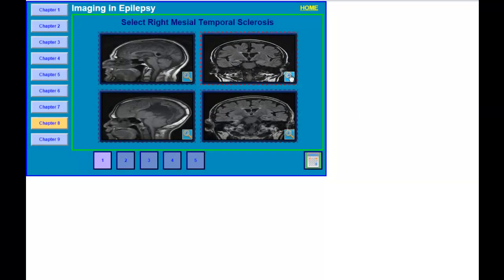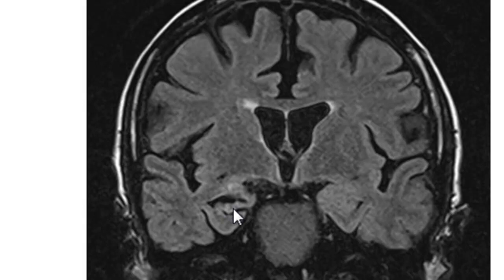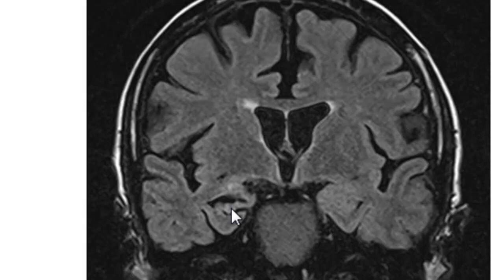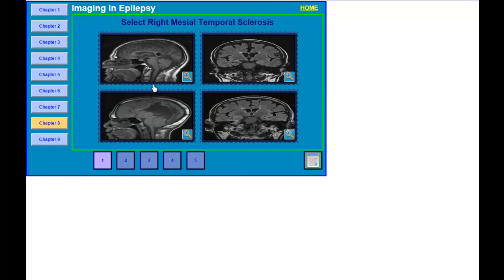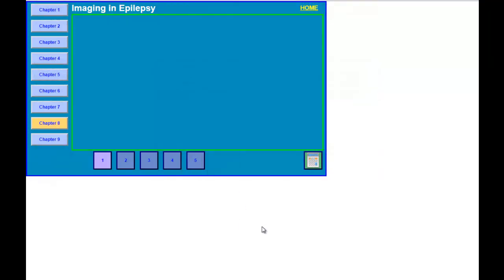Looking at the last image, you are able to identify right mesial temporal lobe sclerosis. The inferior horn of the lateral ventricle is more prominent here. There is a slight increase in signal and, compared to the left side, you can see the hippocampus is smaller. Patients with hippocampal sclerosis can present with spacing out, blanking out, and déjà vu sensation. These seizures typically do not evolve into a secondarily generalized tonic-clonic seizure unless the patient stops their medication. The correct answer is right mesial temporal sclerosis.